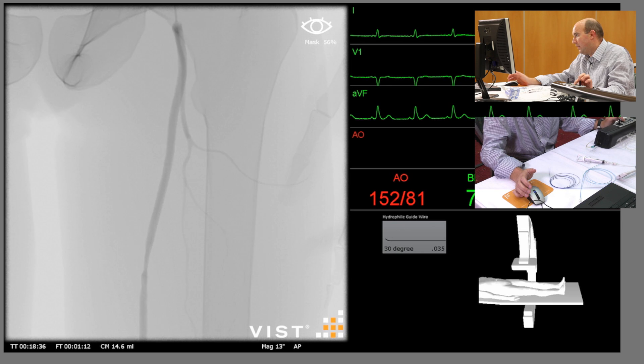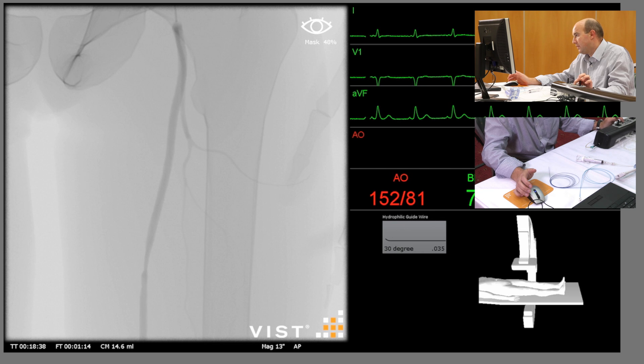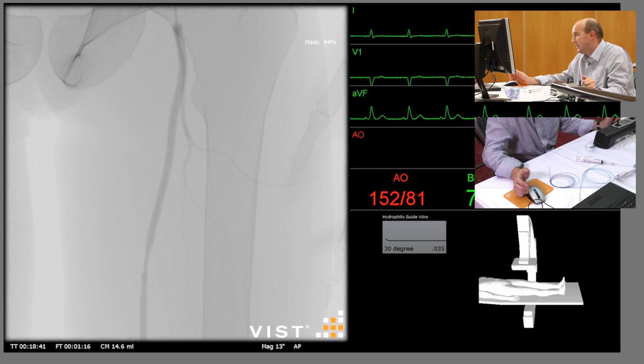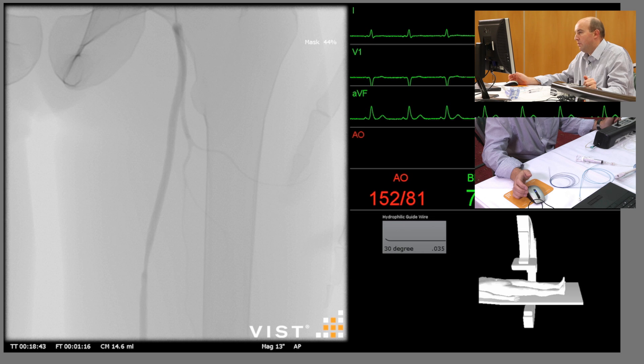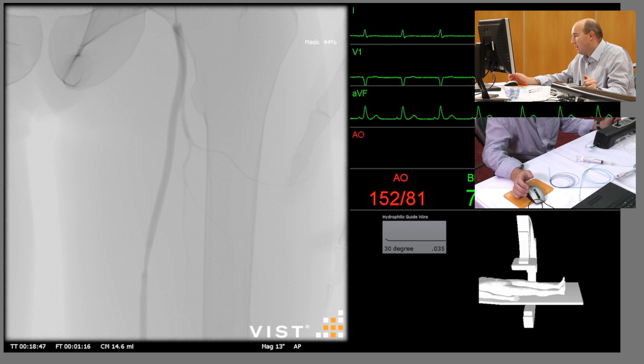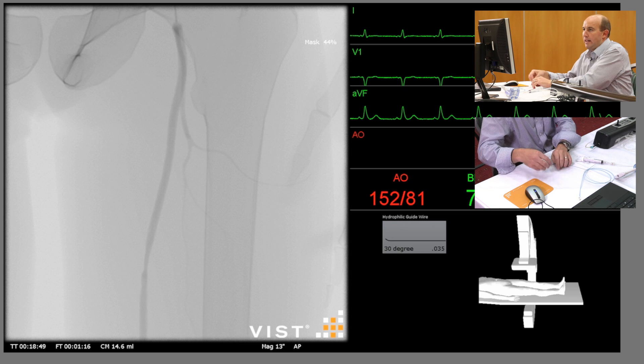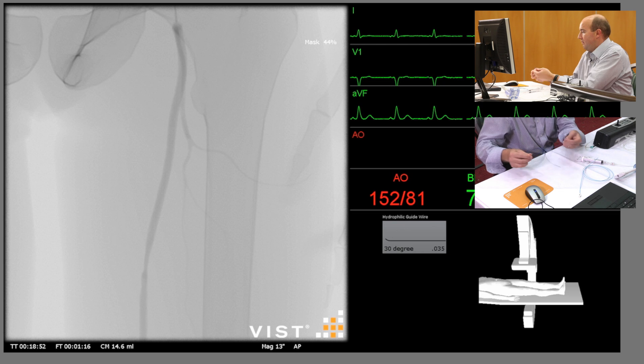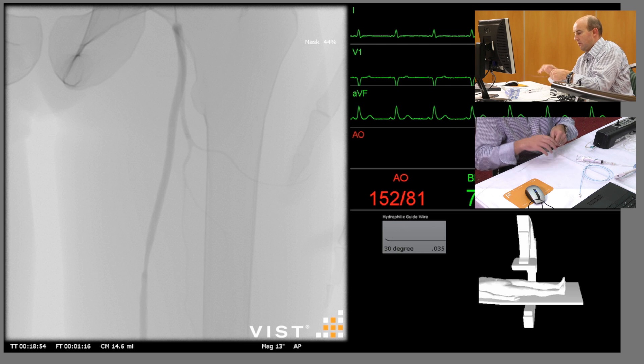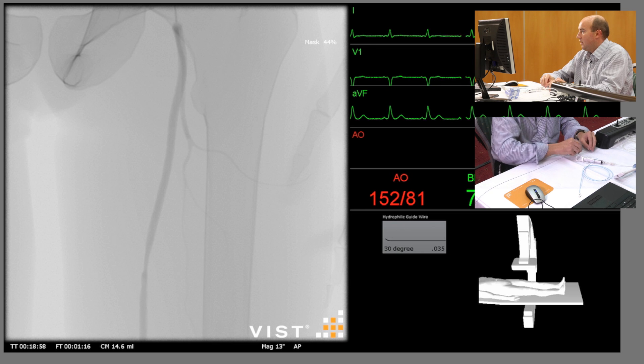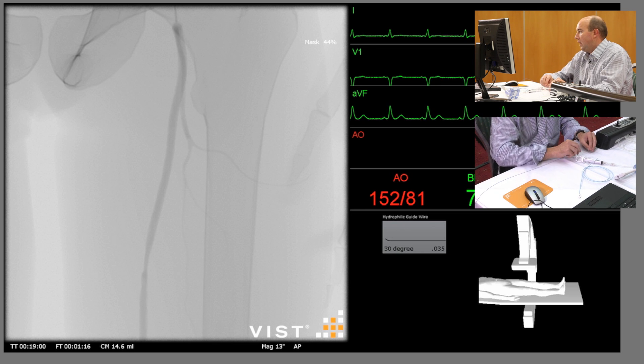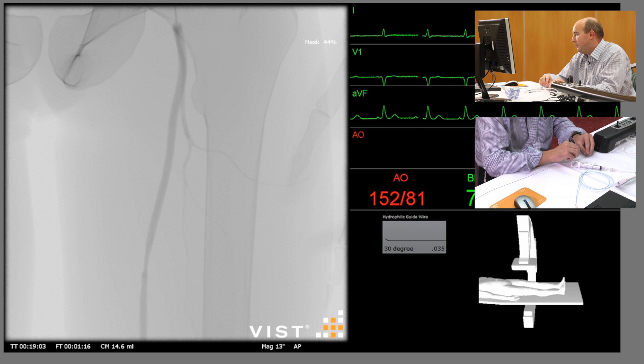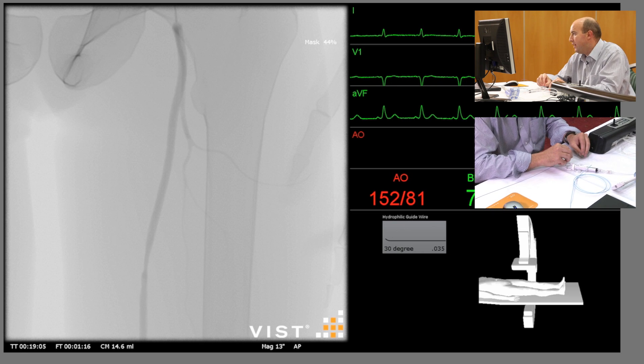With screening we can fade in and out in order to see the lesion, but also ultimately to see the wire and whatever balloon that we're going to use to treat that segment. So we've already pre-selected the wire which we'll now take out and insert through the sheath.